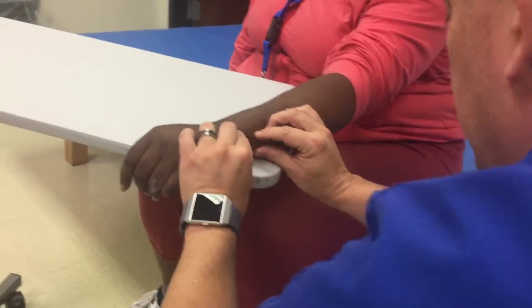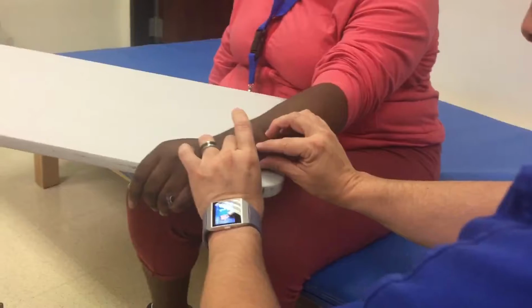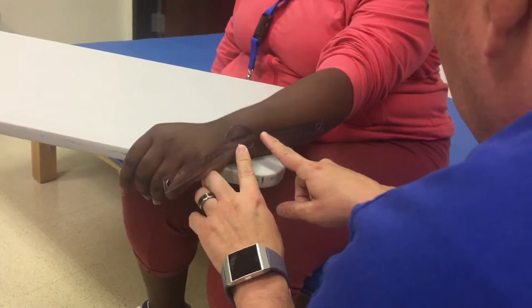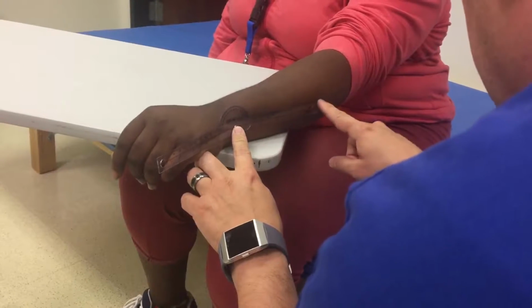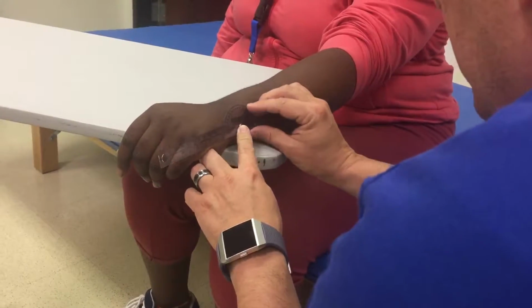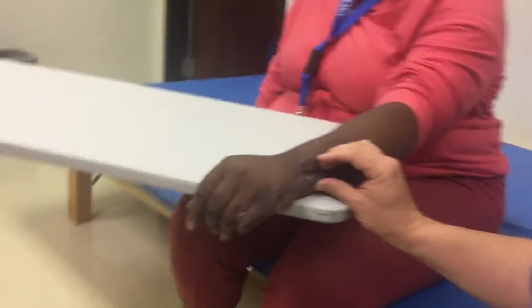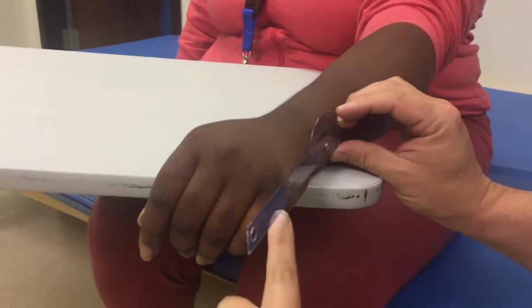Okay, so the axis of rotation is just distal to her ulnar styloid process. The stable arm is going to be in the middle of her forearm. The movable arm is going to be lined up with her fifth metacarpal, and it's laying on top of it, right here.